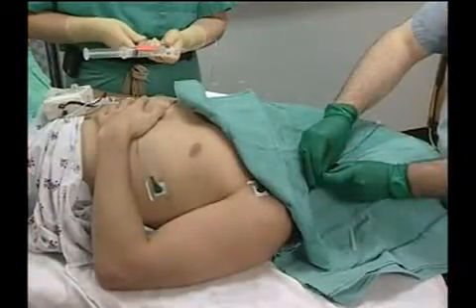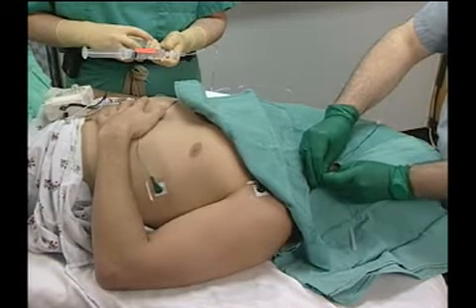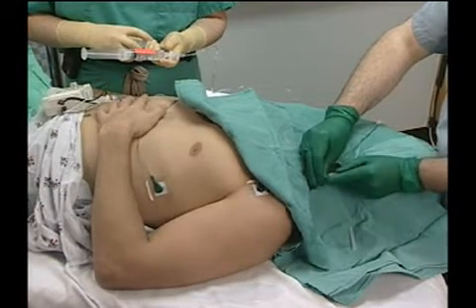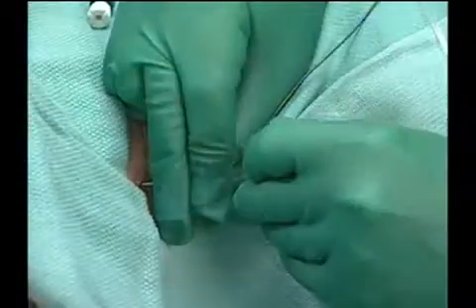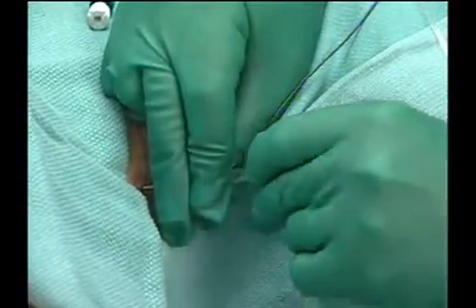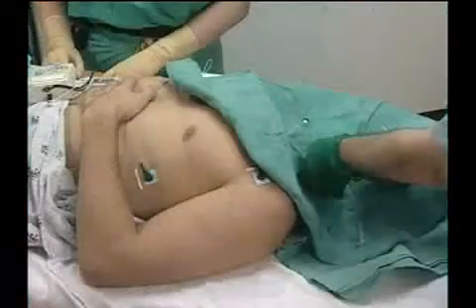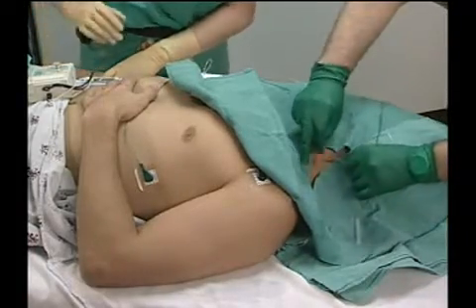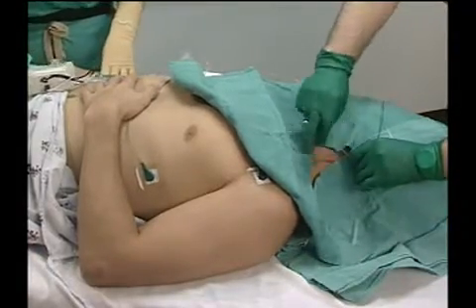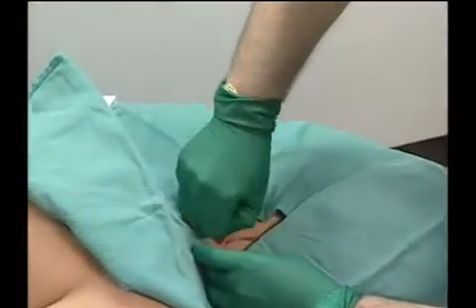After negative aspiration for blood, 30 to 40 cc's of local anesthetic is slowly injected, 5 cc's at a time with aspiration in between. Then the catheter is introduced 3 to 5 centimeters beyond the tip of the needle and the introducer needle is pulled. To secure the catheter, it is tunneled under the skin.